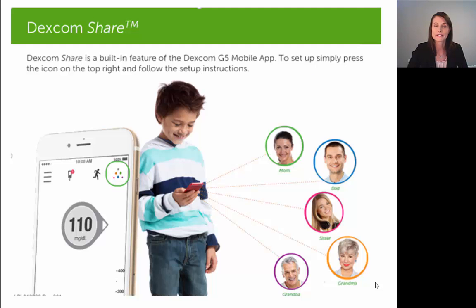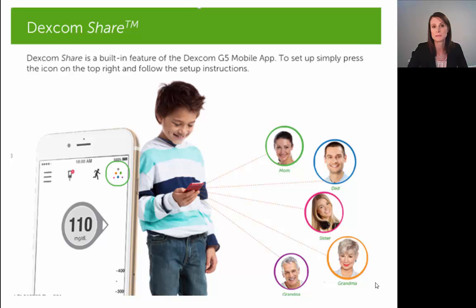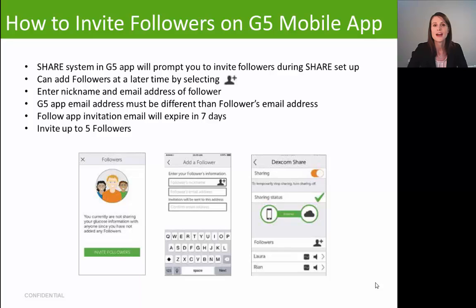Dexcom Share is a feature now integrated into the Dexcom G5 mobile app. It allows the patient to share their glucose information in real time with up to five loved ones or family members called followers. Share is represented by a little triangular icon in the upper right-hand corner of your G5 app. When that icon is multicolored, share is set up, active, and working properly. If the icon is black with a red dot next to it, share is set up but not functioning properly and your follower is likely not receiving your glucose information.